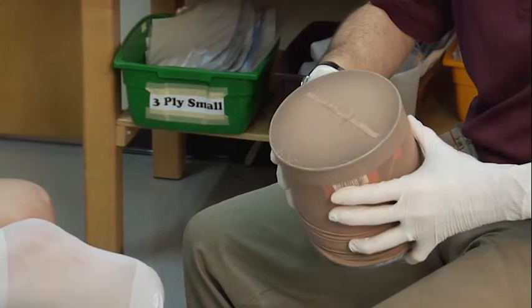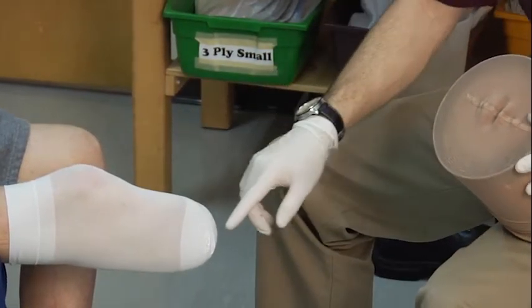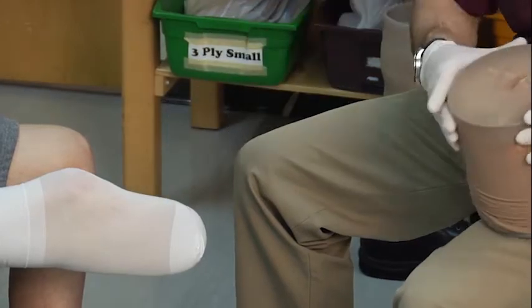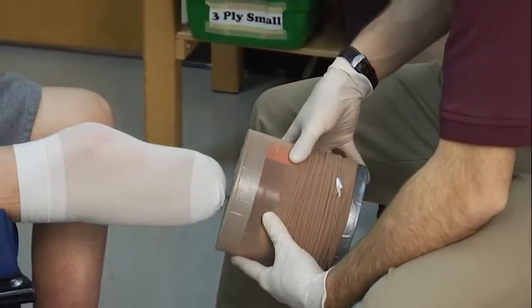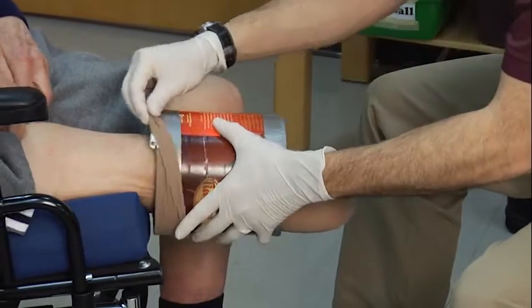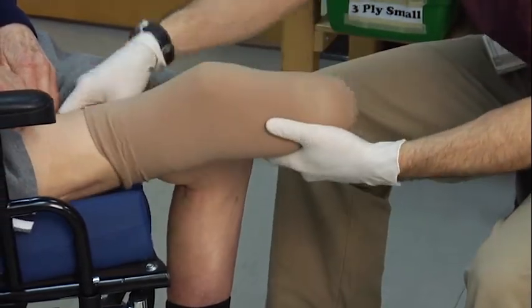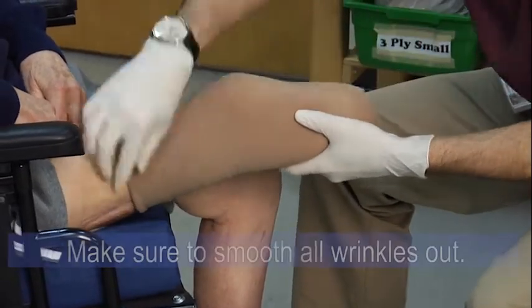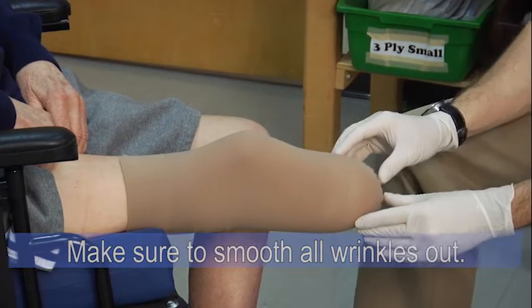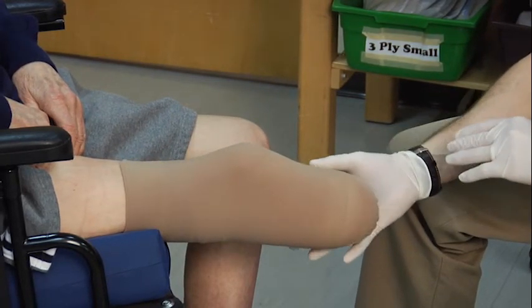When I apply the shrinker sock to the patient's limb, I want to make sure that the seam is at an oblique angle to the patient's incision line. The reason for that is the seam could cause some irritation along the incision line, and if we go vertically it could cause some issues on the shaft of the tibia. So I'm going to take the tightened shrinker sock at that oblique angle and gently roll it onto the patient's limb. I'll ensure that all creases have been pulled out, the sock is fully pulled up to avoid a tourniquet effect, and the seam is tight along the bottom to ensure there's no space — where there's space, it will allow tissue and fluid to collect and create issues on the distal end of the limb.